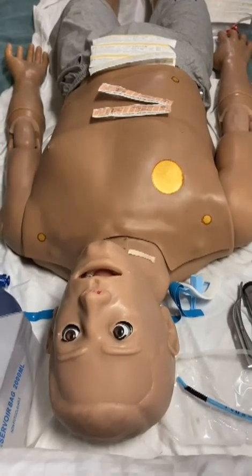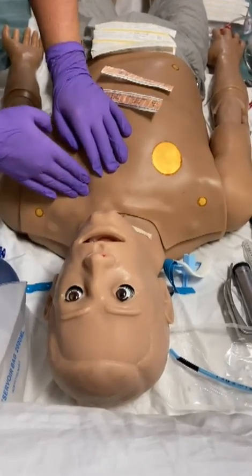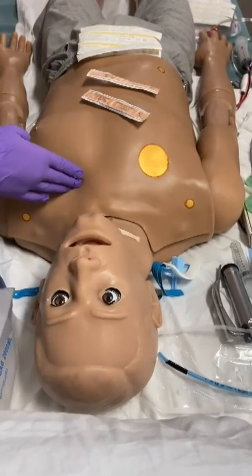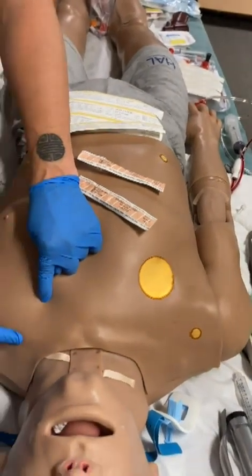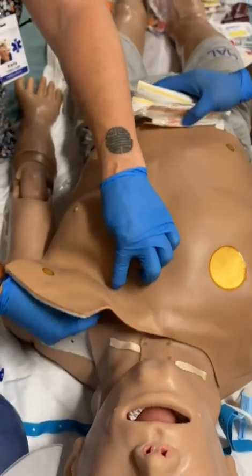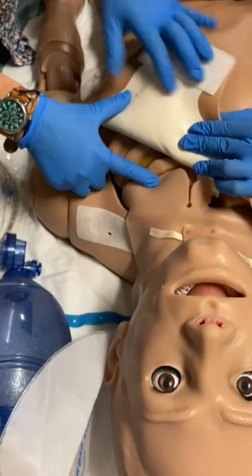Well, that's hard. I palpate to find the second and third intercostal space. I'm guessing it's right there — it's hard to actually feel anything. All right, so this is where we're thinking — this is your money shot. So before we reveal that, here's the collarbone: one, first intercostal space, two — that might be it, but let's see where we're at. Let's pull this back and reveal. That's where we're at — can be a little deceiving, especially on mannequins.